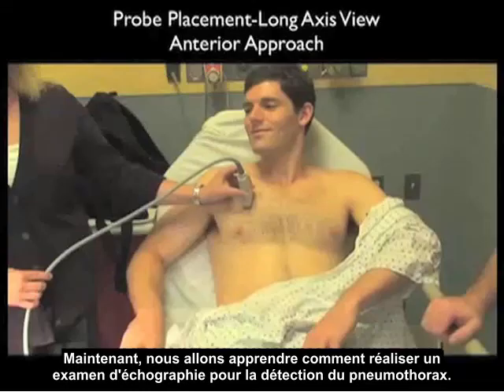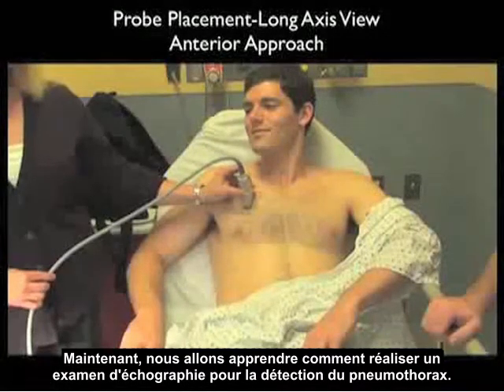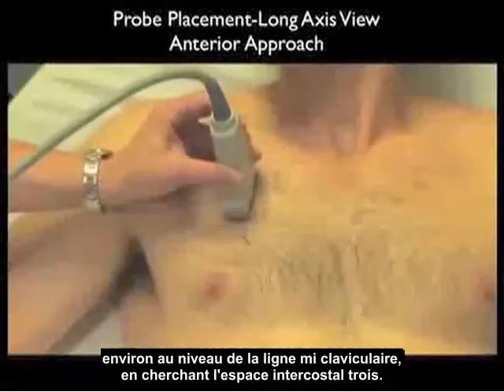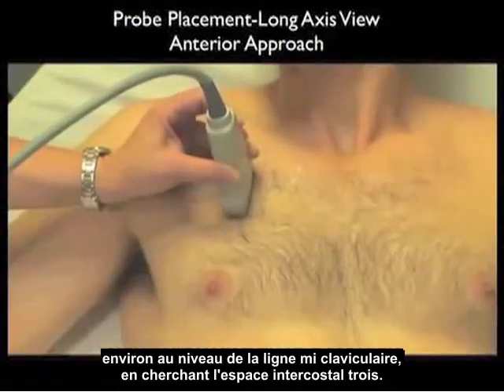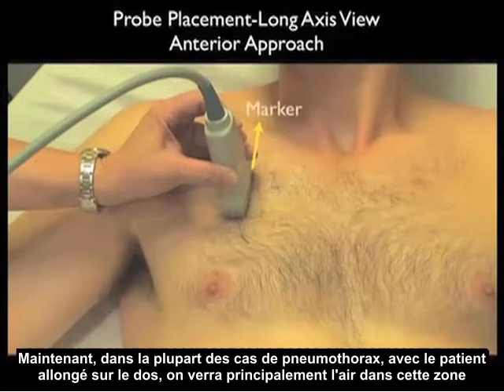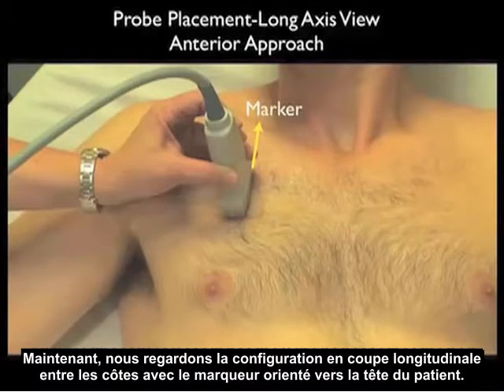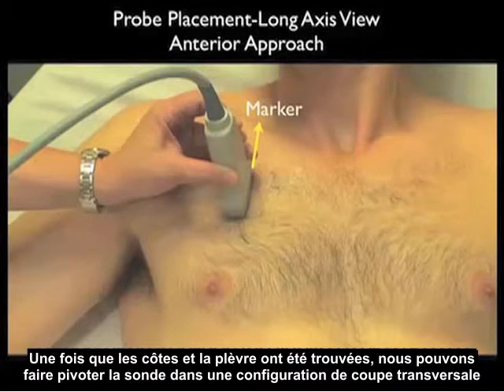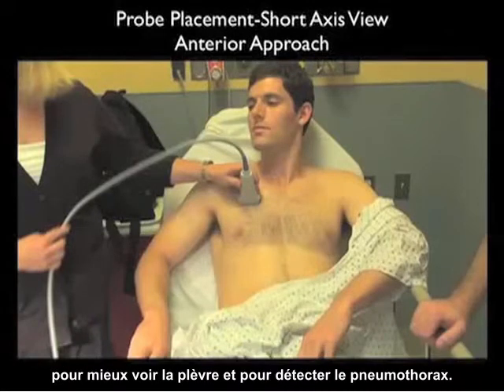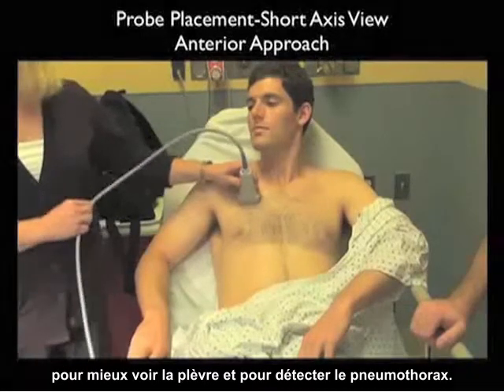Here we have the high-frequency linear array probe positioned on the anterior chest wall at about the mid-clavicular line, looking into about intercostal space 3. In most cases of pneumothorax with the patient supine, the air would be predominantly seen in this area. We're looking in a long axis configuration between the ribs with the marker dot oriented superiorly towards the patient's head. Once we've identified both the ribs and the pleura, we can swivel the probe into the short axis configuration to further look at the pleura and detect pneumothorax.